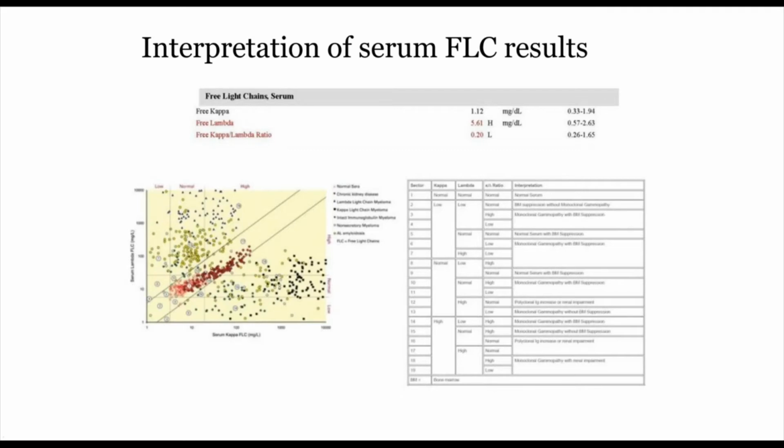Sure. As I mentioned in my closing slide, one of the things that's very important for laboratorians is that when you do have an assay on the market, the validation is important, not just from a regulatory viewpoint, but also from a patient care perspective. For those laboratories that do want to switch or are planning on switching, and this is not just for free light chain assays, but for any other assay, it's very important that they consult with the clinicians. They inform the clinicians that they plan on switching and that they do the switch in collaboration with them, because as we've seen in this particular example, you could end up with clinicians confused with the interpretation of the results. And by working with the clinical staff when you do these switches, you tend to prevent any future problems that may occur as a result of an assay switch.